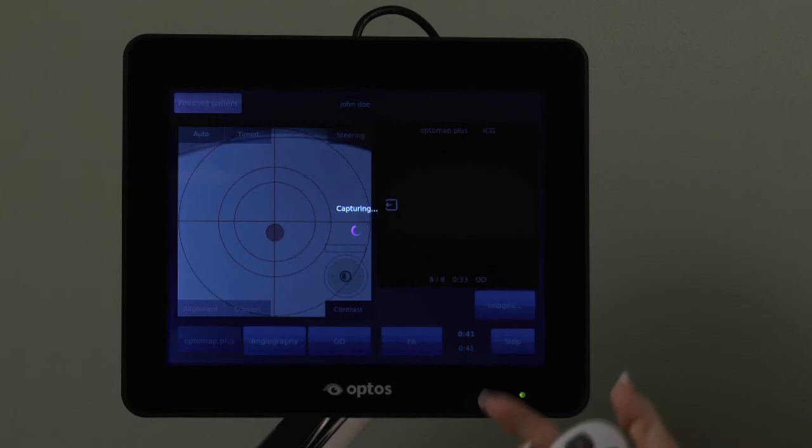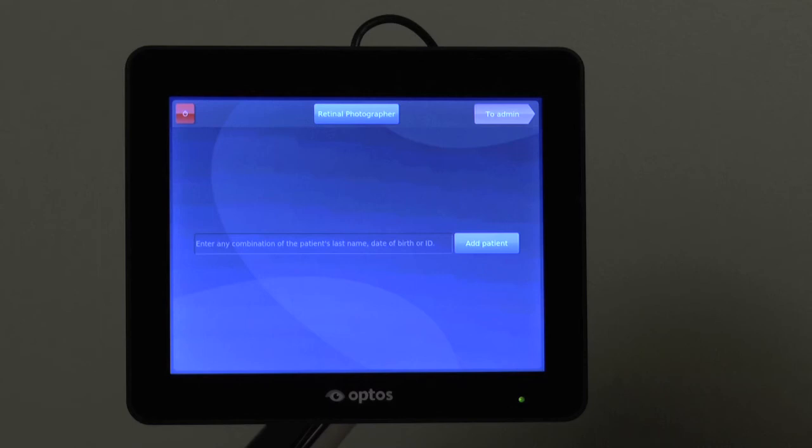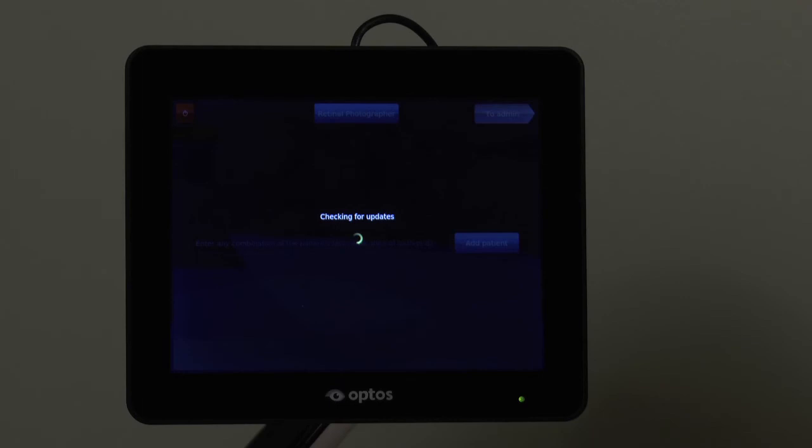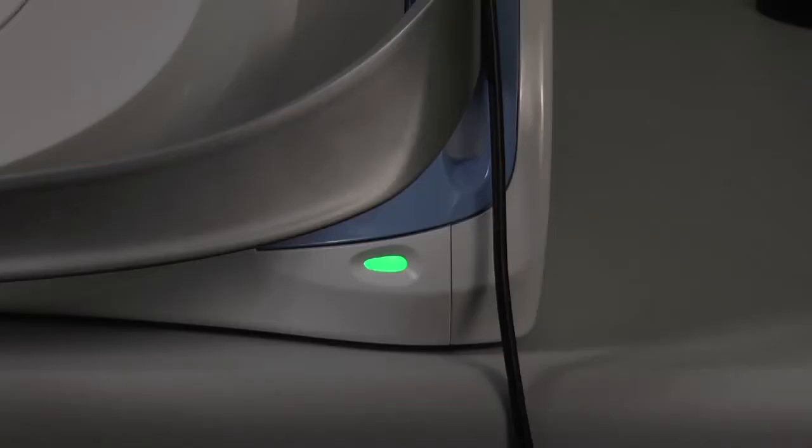When you are finished for the day, touch the red Shutdown button at the top left and confirm by tapping the Shut Down the System tab. The device will check for updates before entering standby mode, with the indicator light turning from green to blue. It is not necessary to turn off the device with the switch in the back. When in standby, simply touch the blue indicator light to activate the device for capture.